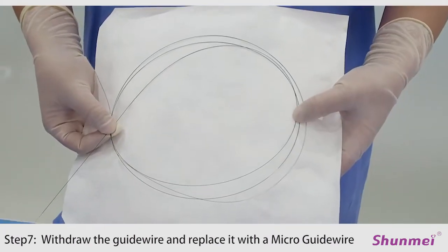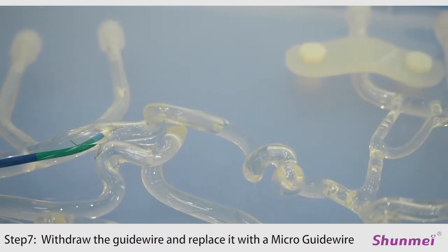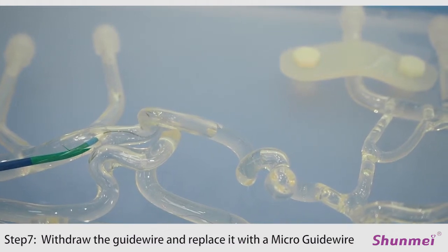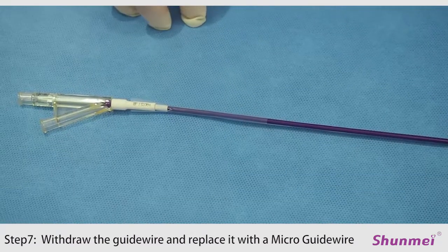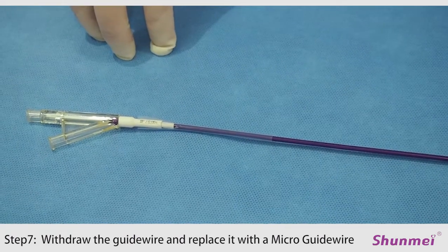Once the guiding catheter reaches the position, withdraw the PTFE-coated guide wire and replace it with the neural micro guide wire of 0.014 inch. Then, insert the micro guide wire into the desired position. In thrombectomy, it is a good choice to use a balloon guide catheter instead of guiding catheter.